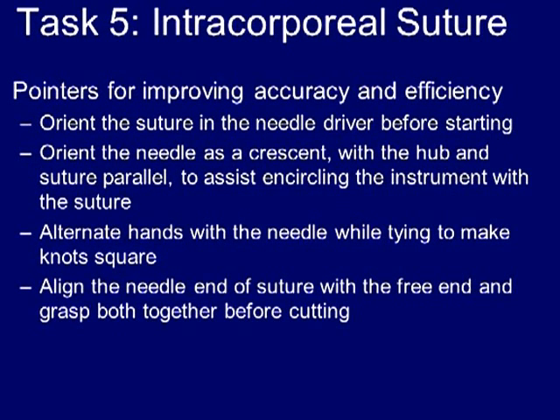Several tips for improving your efficiency on the intracorporeal suturing. You can orient the suture in the needle driver before introducing any of the instruments into the box. The needle should be oriented in the direction that it will be helpful to grasp it with the right hand and start the exercise immediately upon delivering the suture into the box. This will be demonstrated in the video demonstration of the exercise.